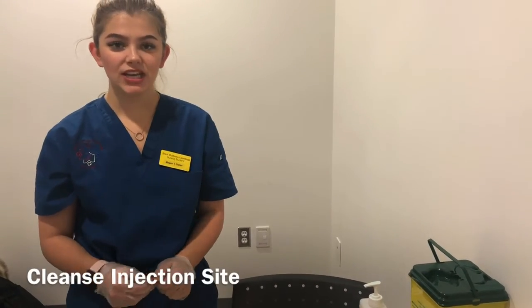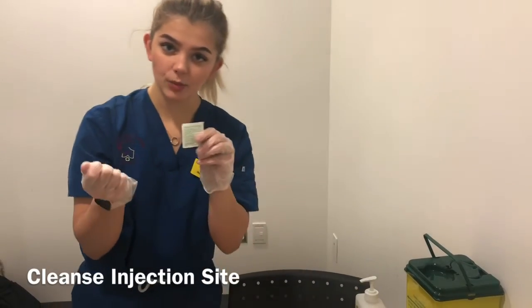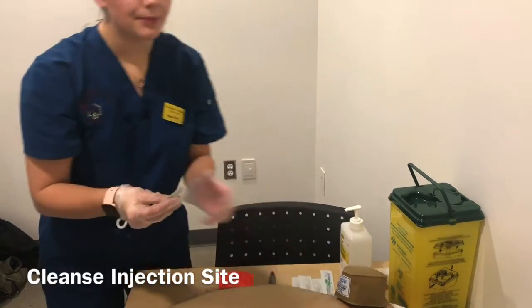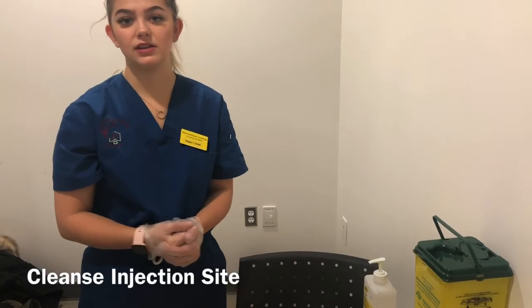Mancini with the medication, I'm just going to ensure I get an alcohol swab, and we're going to pretend that I opened it, and we're just going to swab the area to make sure it is clean. Before I inject the medication, I'm also just going to let the area dry for about 15 to 20 seconds.